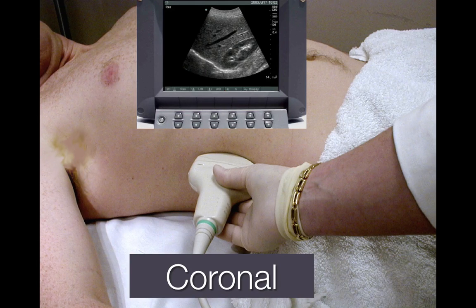Coronal is another term that we use to describe a view, a slice from the side of the patient in the mid-axillary area. By convention, the indicator is oriented towards the head. And that matches with the dot on the screen so that we know that this is the diaphragm, this is the liver, and this is the kidney. The dot is towards the head, opposite is towards the feet.